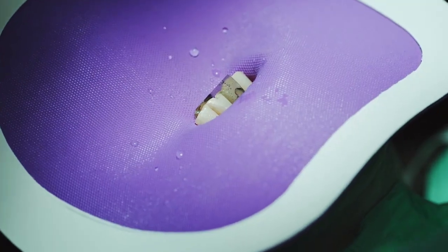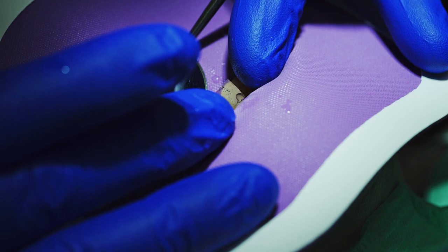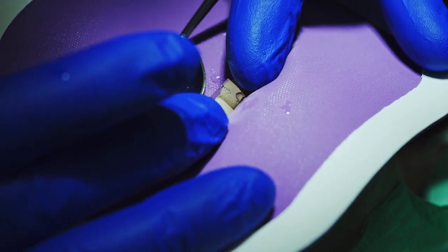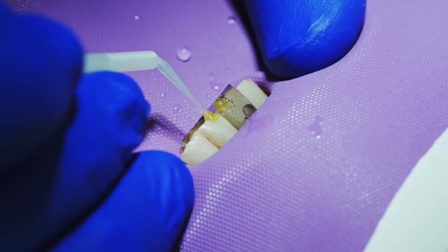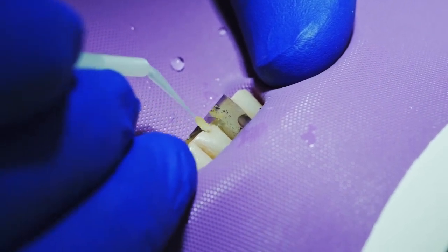One of the beauties of this particular system is it is compatible with any composite resin and any adhesive system that you may have. It also will accept any curing wavelength of any light that you may own. We will prime and bond — we're using some 3M products — and just follow the manufacturer's suggested times.